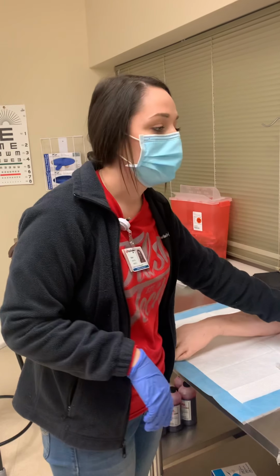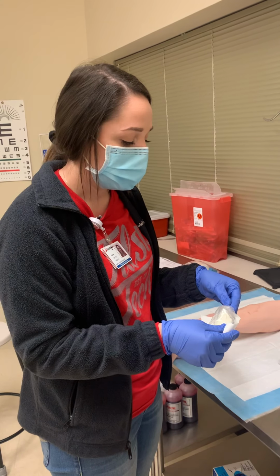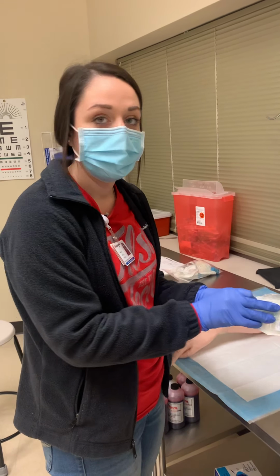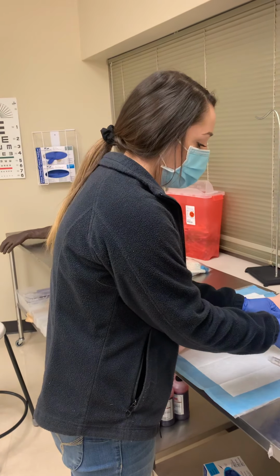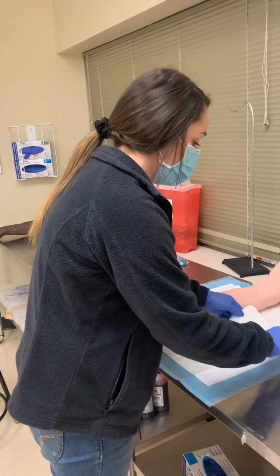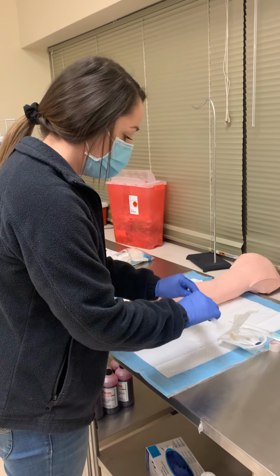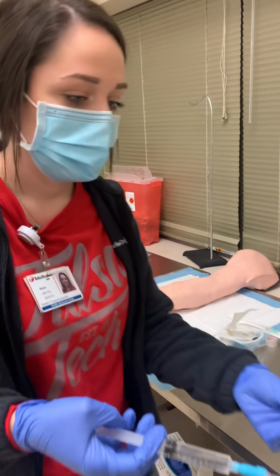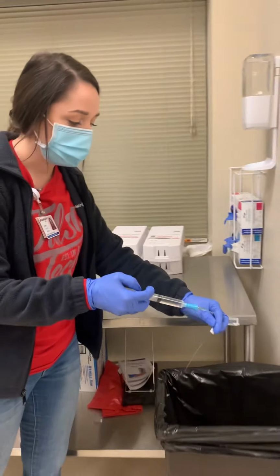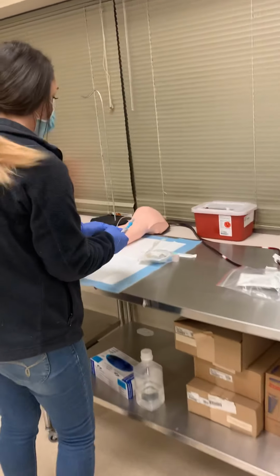I would apply a warm compress for several minutes, and then if the site looks like it needs to be cleaned, I would clean with soap and water. I would open up my package while keeping aseptic technique. I would prep my saline flush, make sure there are no air bubbles, and then lock it, and then place it back in the sterile container.